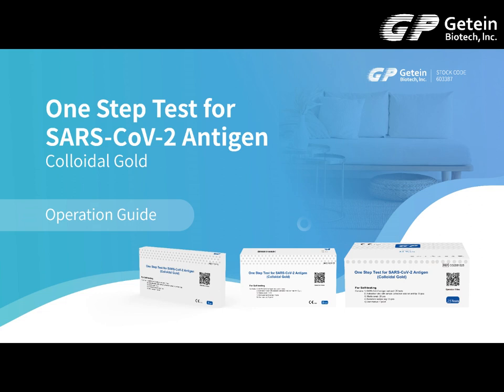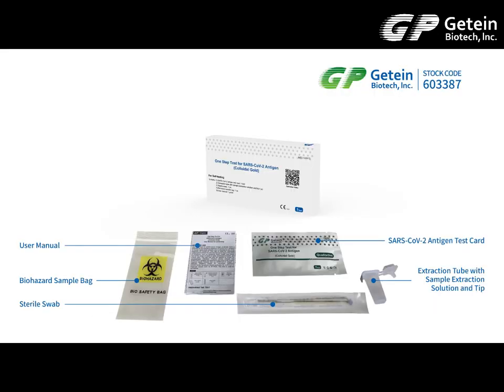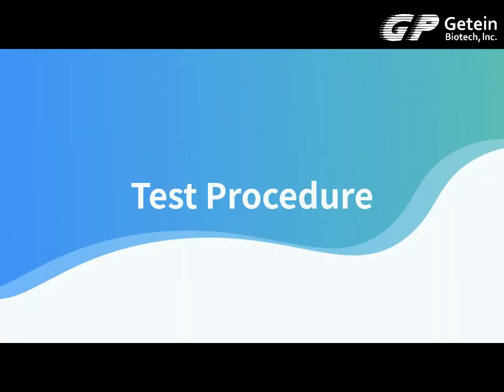One-step test for SARS-CoV-2. Adigen Colloidal Gold Operation Guide. Test Kit Content. Test Procedure.